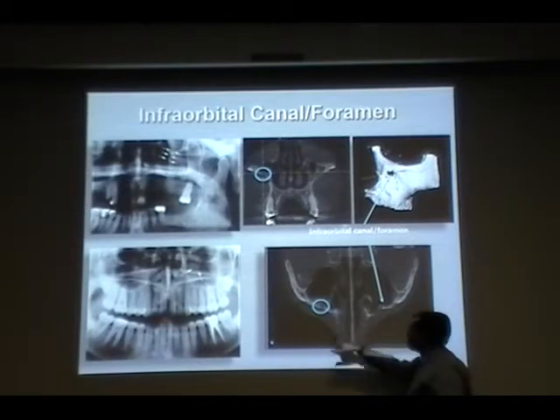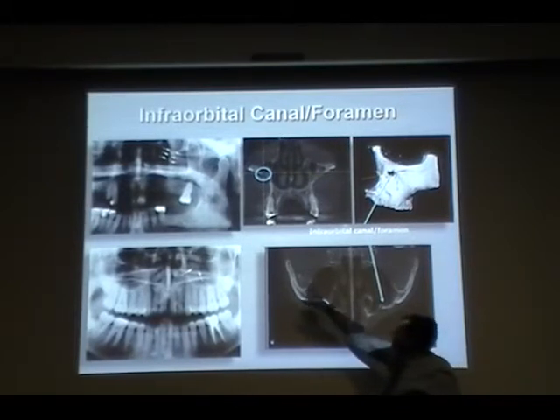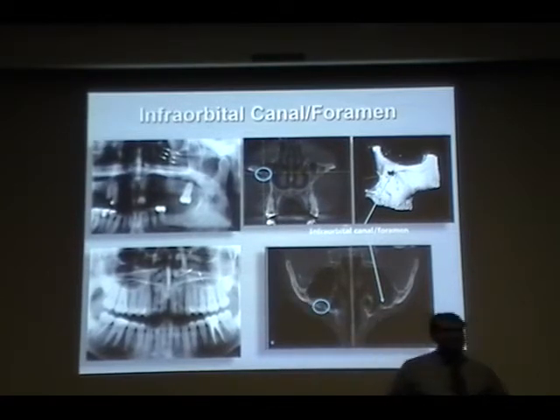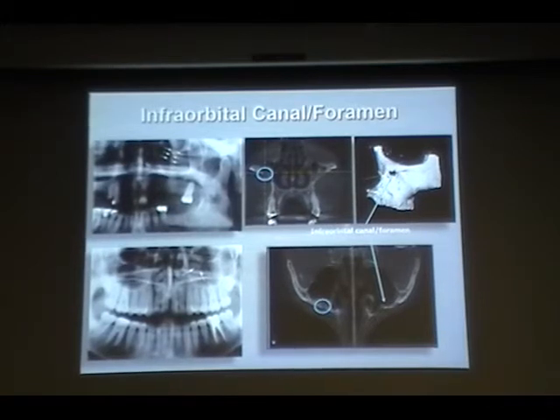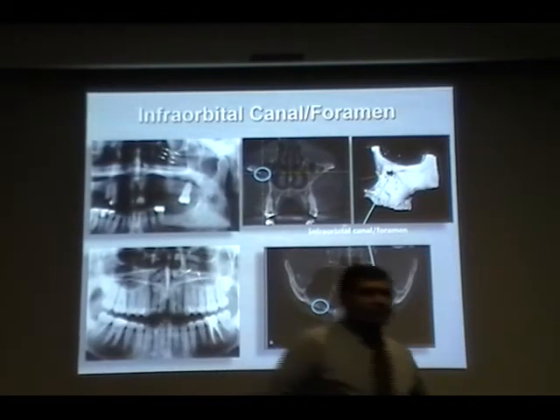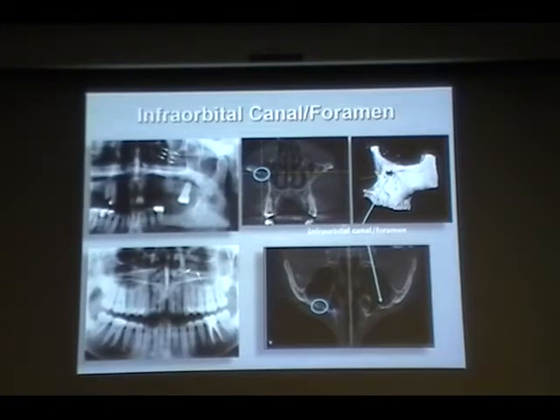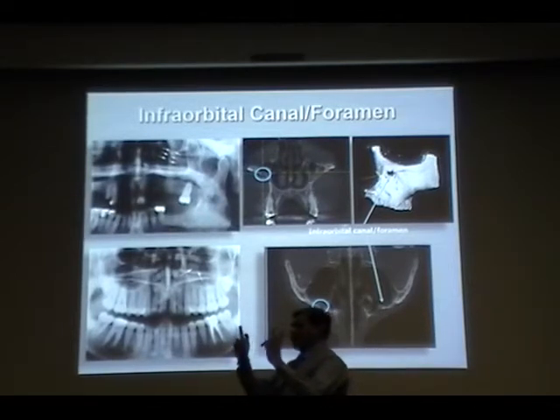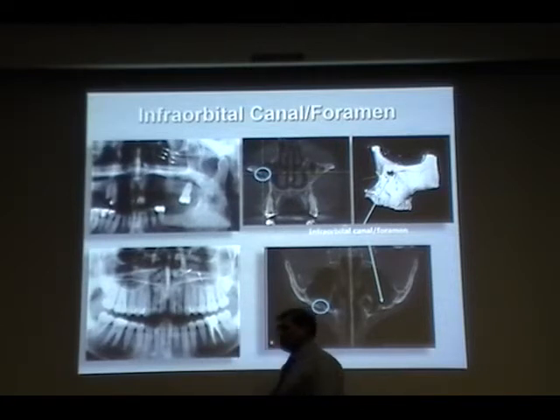Again, right side, left side. So this is the maxillary sinus. Do you know what structure this one is? It's located anterior to the condyle. It starts with a letter and ends with process. Yes. That's the coronoid process, this one here. So the mandible sits like this, not like this. Okay, so you have the condyle and the coronoid process.